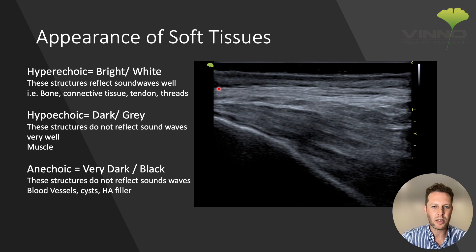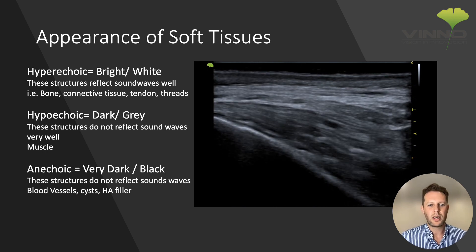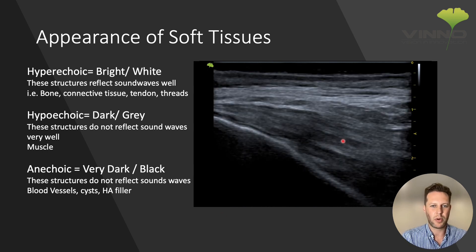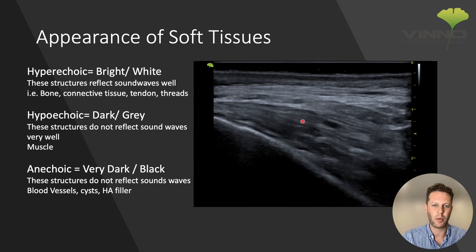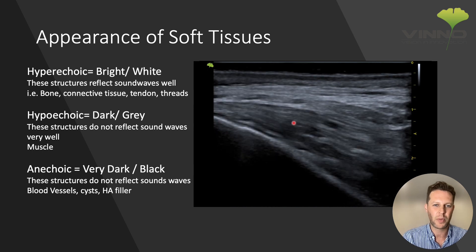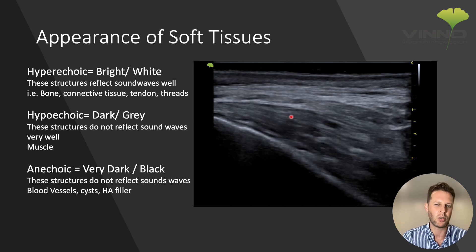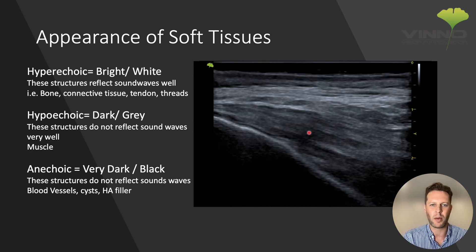This is the superficial temporal fascia and we can see the layers of the temporal fascia, including the deeper temporal fascia. Right at the top of the screen we also have the skin, which is also reflective of sound. If we play this video we can see a structure moving towards the bottom of the image — this is the temporalis muscle, and we can see that it is darker than the surrounding structures. We call this hypoechoic. It's not completely black, which would be anechoic; it's hypoechoic, and muscle is a really good example of a hypoechoic structure.